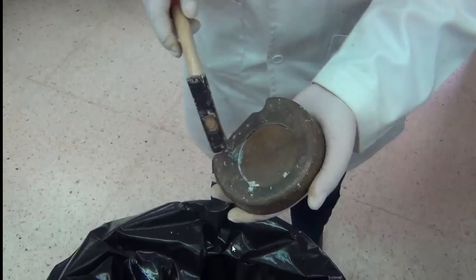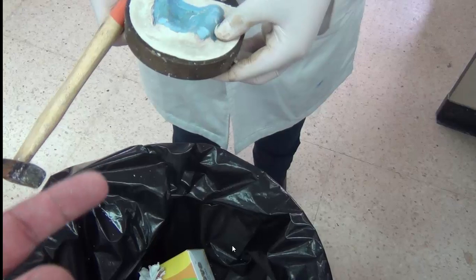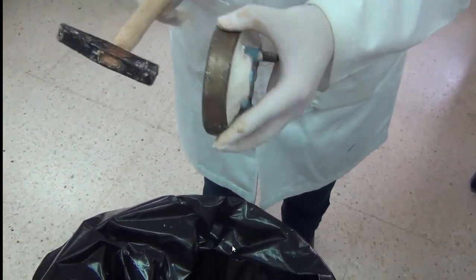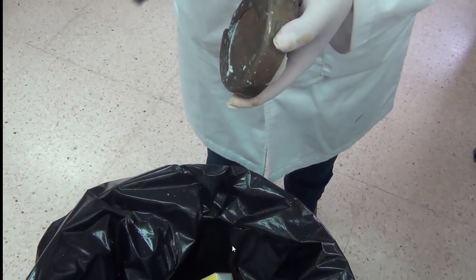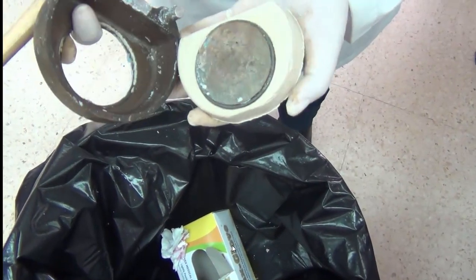Okay, so we'll continue with our first separation. Now we want to separate the cast from the plaster around. It's better or easier to begin by separating the plaster from the flask itself, the lower member of the flask. So we hammer and we try to control the hammering over the lid area.